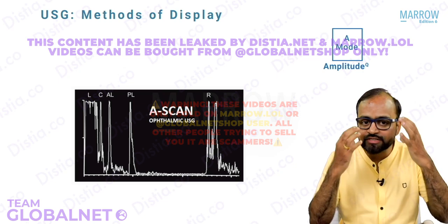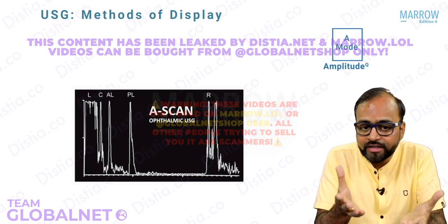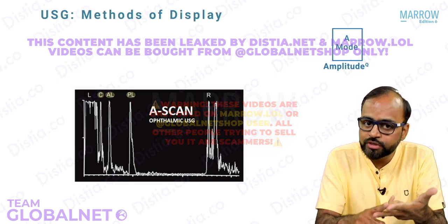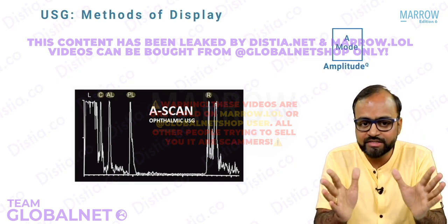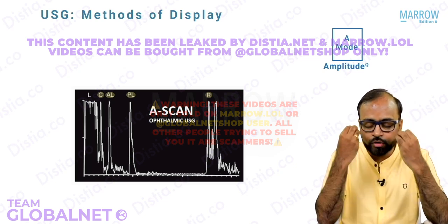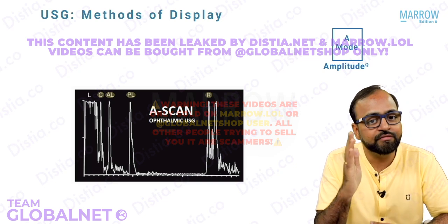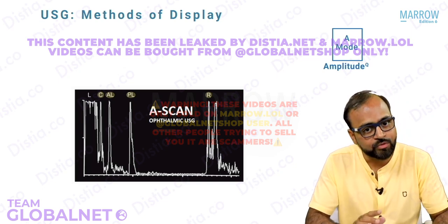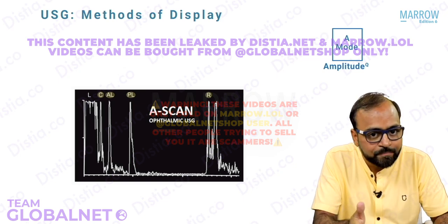See, the ocular structure is very uniform. There are very few reflecting surfaces. What are those? Cornea, anterior capsule of lens, posterior capsule of lens, retina. That's it. So when I do A mode on the closed eyelid, a probe is kept. There are only 4 reflecting surfaces. They can very well be plotted. This is how a normal A mode ultrasound of the eye looks, right?